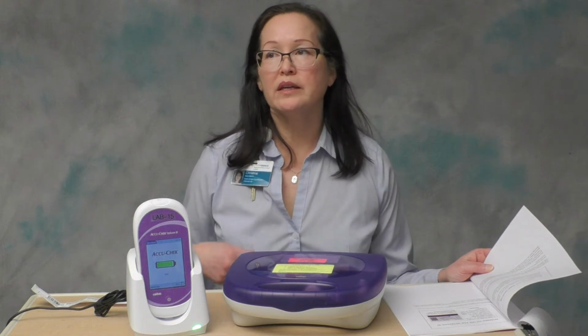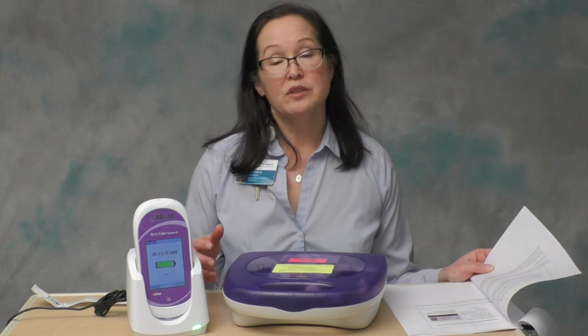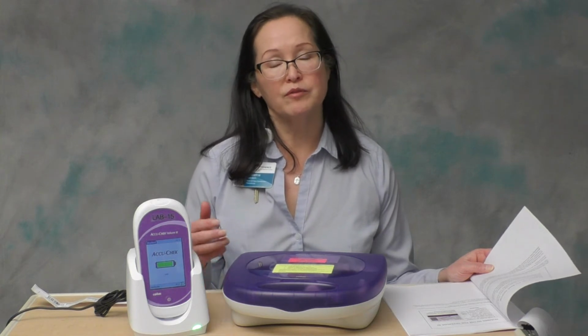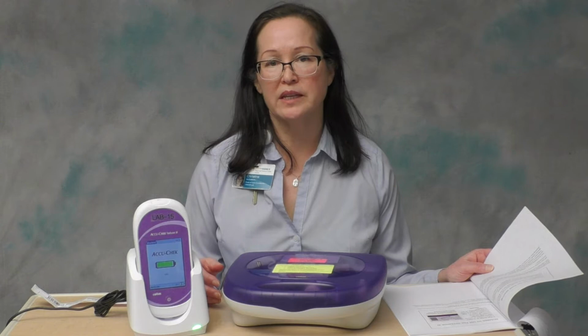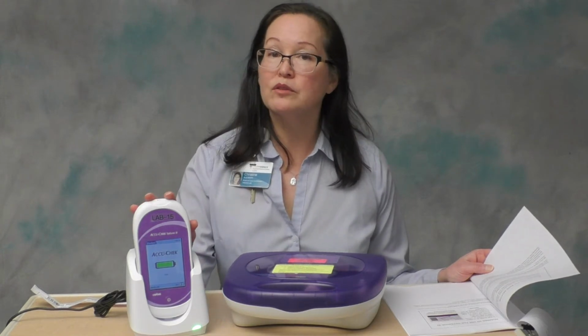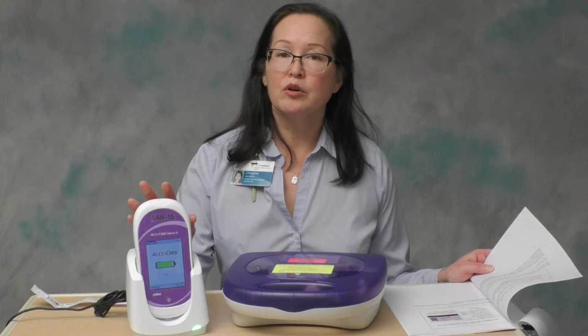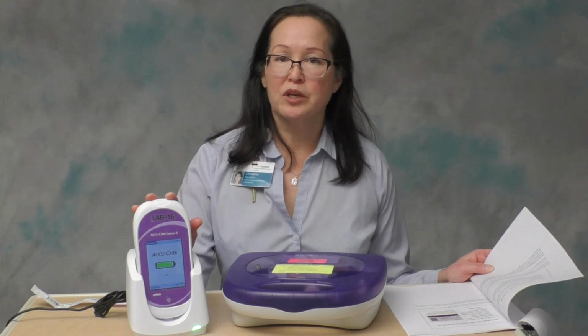What that will look like is once a year you'll have to complete a health stream module and pass the test. In addition to the health stream, you'll be required to run 2 levels of quality control on the meter within 1 year of your certification expiration.